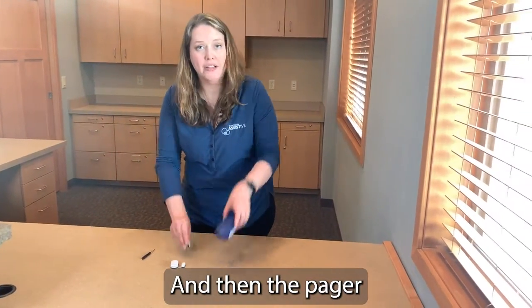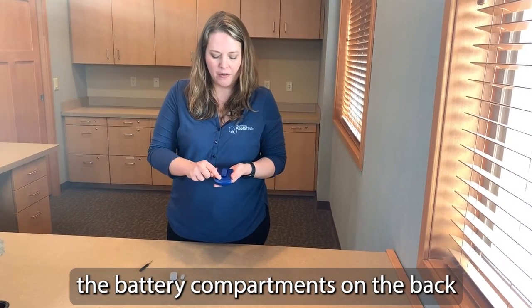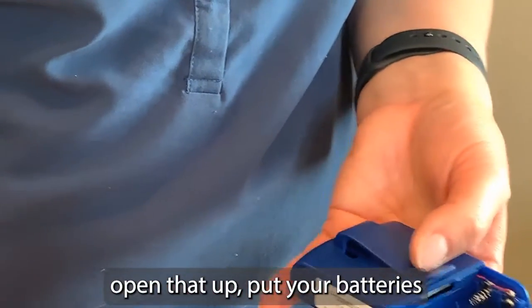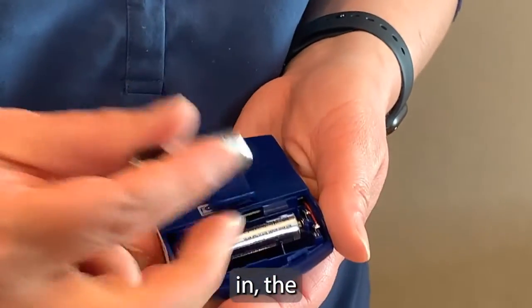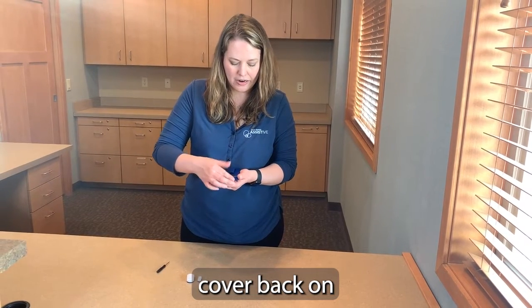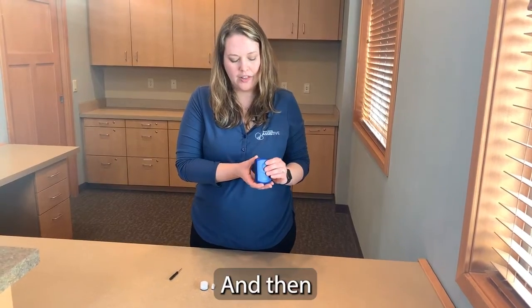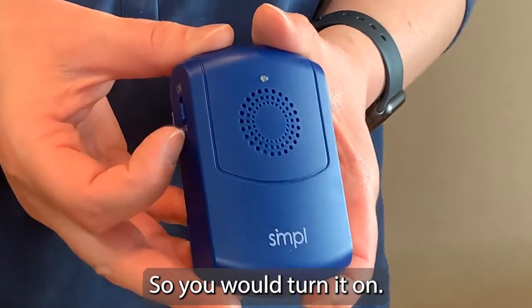Then for the pager, you put in two AAA batteries. The battery compartment is on the back — open that up and put your batteries in, then cover back on. There's a little switch on the side to turn it on and off, so you would turn it on and the person would put it on their belt.